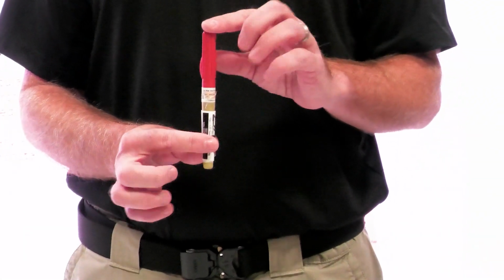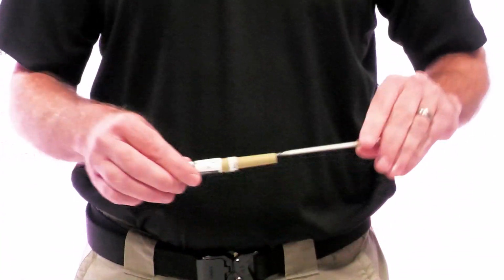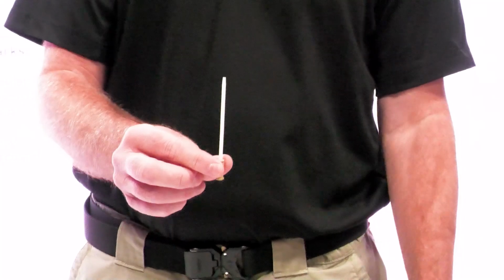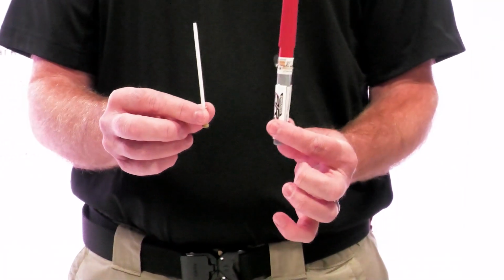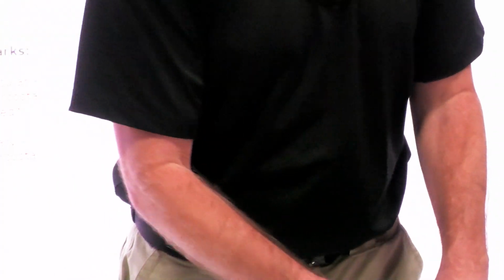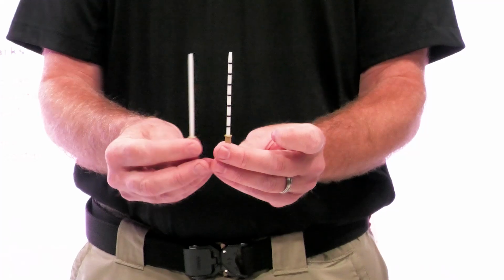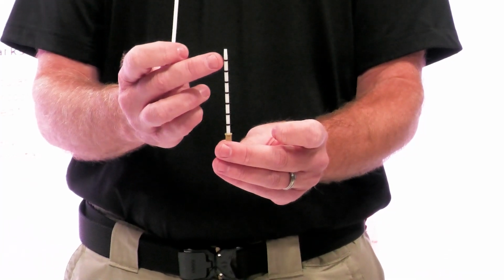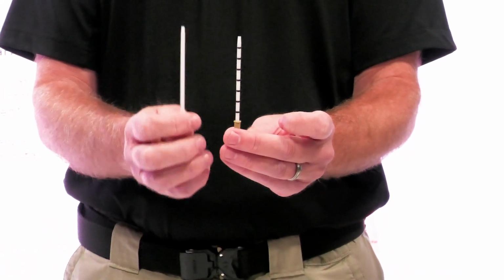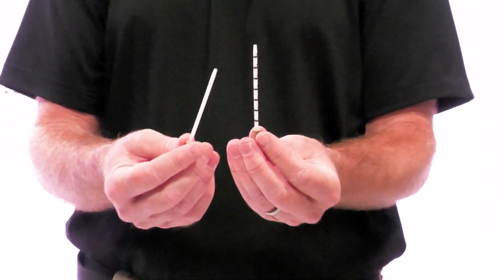Currently, in all the apparatuses we have the decompression needle that you are very, very familiar with. But we are now getting our new decompression needles. They're the same thing, 10 gauge, 3 1/4 inch needle. What I want to show you is that these little black lines are a little thicker. They're almost like a ridge, and that will prevent the intercostal muscles from collapsing the catheter.